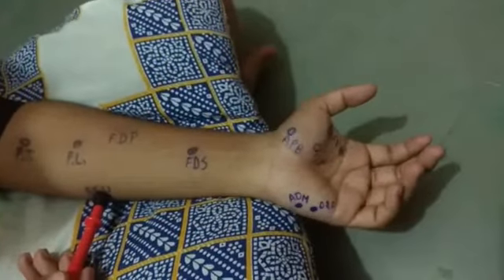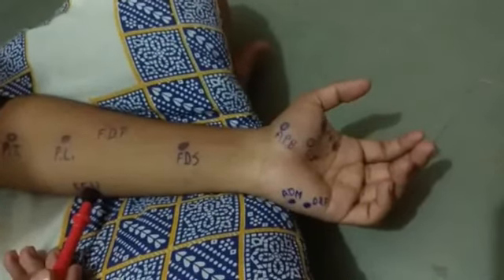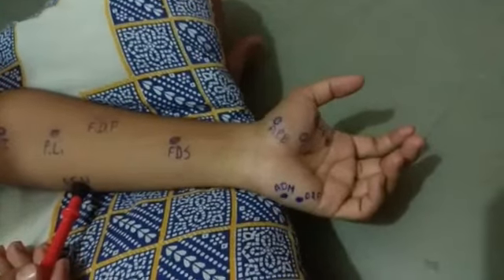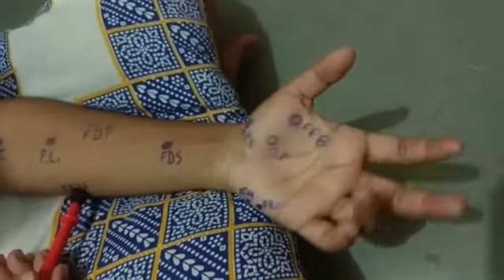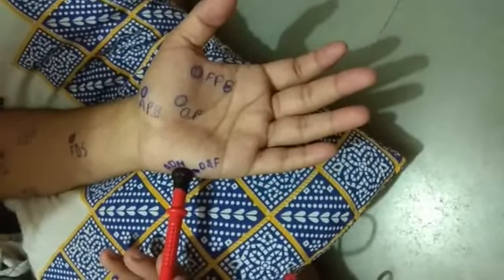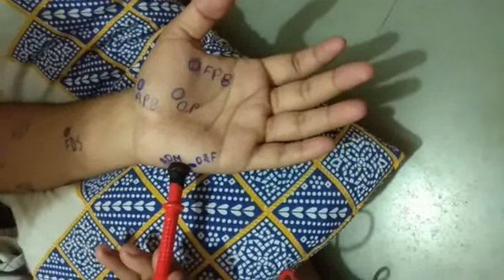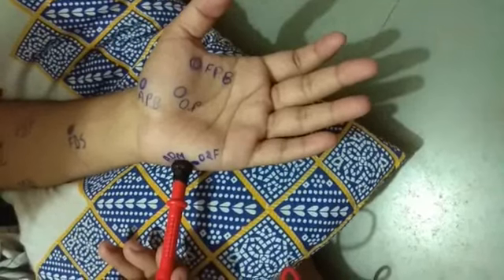This is the motor point for the flexor carpi ulnaris muscle. The action of flexor carpi ulnaris is flexion with ulnar deviation of the wrist joint. This is the motor point for the abductor digiti minimi muscle. The action of abductor digiti minimi is abduction of the little finger.